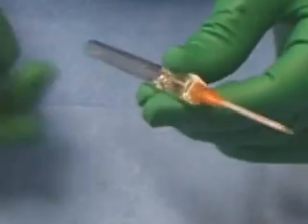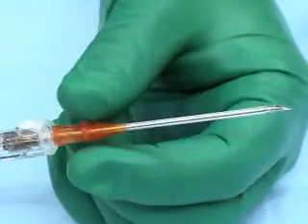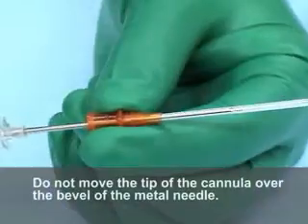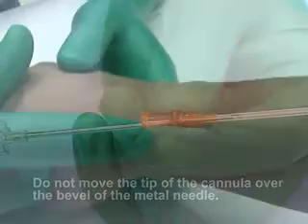Both should be smooth. Spin the hub of the plastic cannula to verify that it moves easily off the metal needle. Do not move the tip of the cannula over the bevel of the metal needle, as this could damage the end of the cannula.